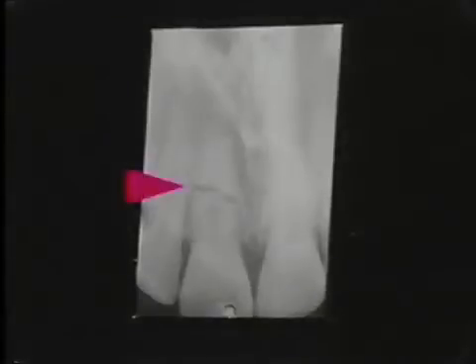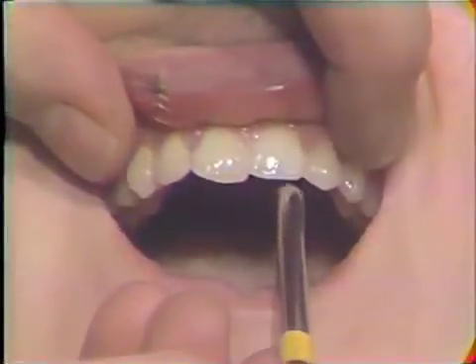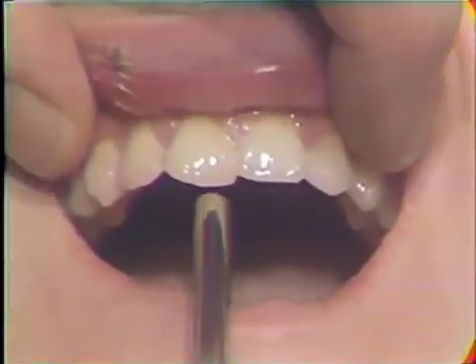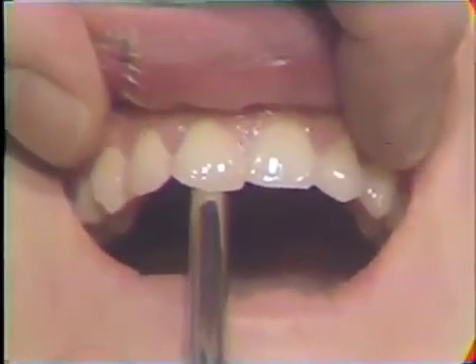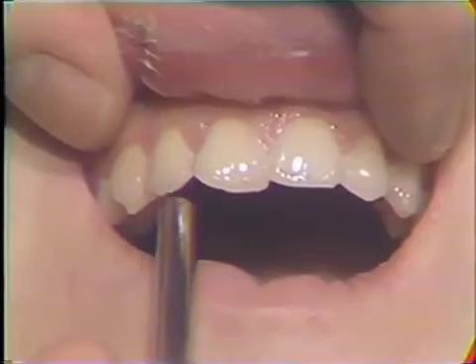Here's an x-ray of the tooth we're going to be splinting. This young man sustained a traumatic injury to the right side of his face, fractured the root on the right central incisor, and loosened the right lateral incisor. Pulling Bob's lip back, we can look at the left central incisor—not involved in the injury—which is a normal healthy tooth showing no mobility. The right central incisor has the root fracture and shows mobility, while the lateral incisor shows a little mobility, but not as much as the central.